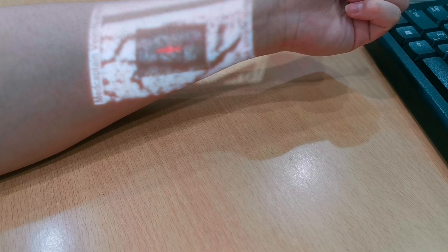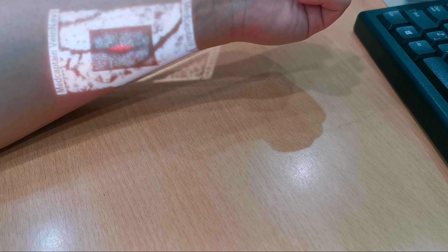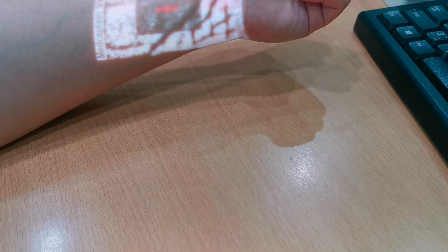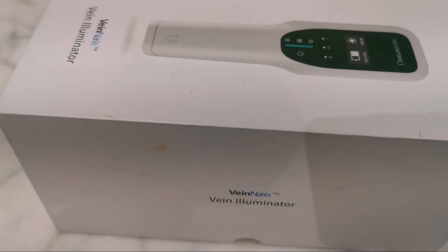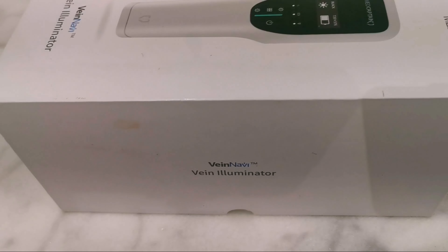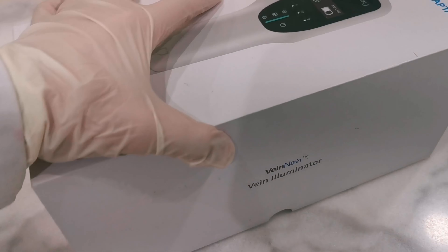If you see two bars of green light, it means the vein depth is 2 to 4 mm and it is relatively shallow. If it shows 1 bar, the vein depth is 0 to 2 mm, meaning the vein is very shallow. If it shows 4 bars of green light, it means the vein is deep.